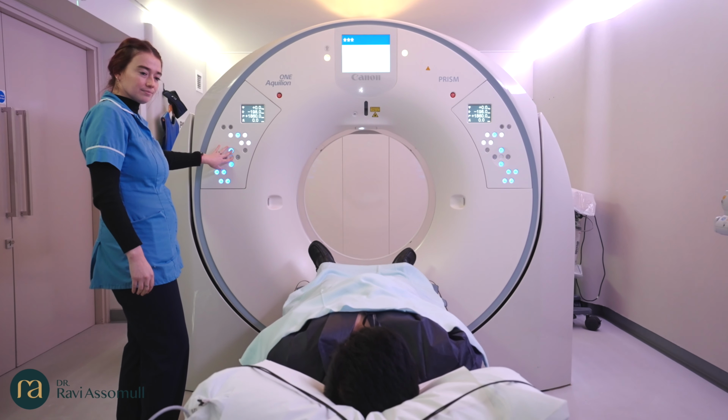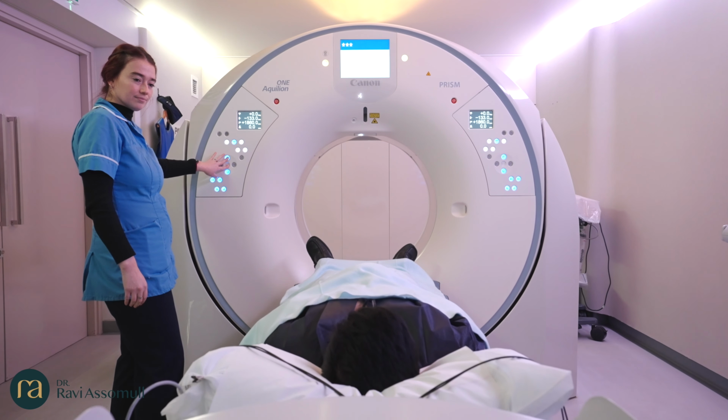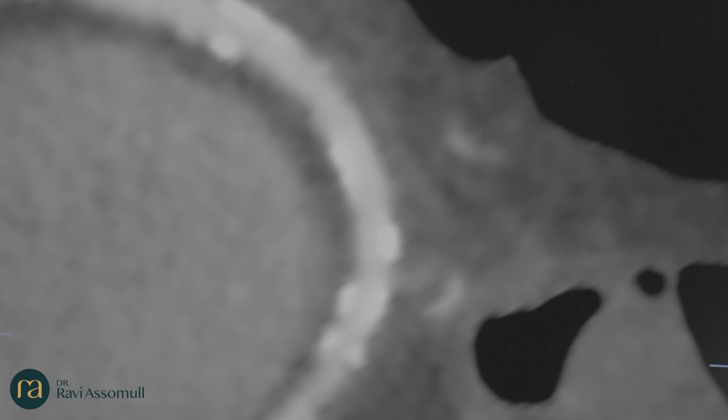There are two distinct phases in having a CT coronary angiogram. The first phase involves no contrast and detects calcified plaques. These are fatty deposits that have become hardened over time. These calcium deposits serve as a marker of atherosclerosis and provide an individualized calcium score. Your calcium score is highly predictive of your future risk of cardiovascular disease.